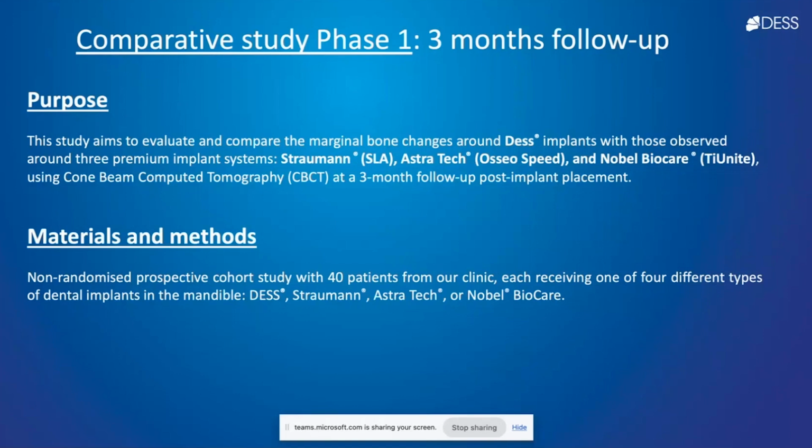We chose Straumann, Nobel Biocare, and Astra Tech, and we assessed the amount of crestal bone loss using CBCT directly during placement of the implant, and 3 months after.